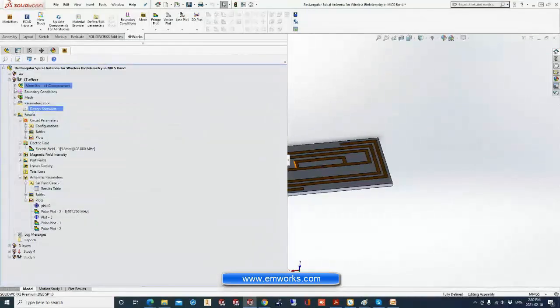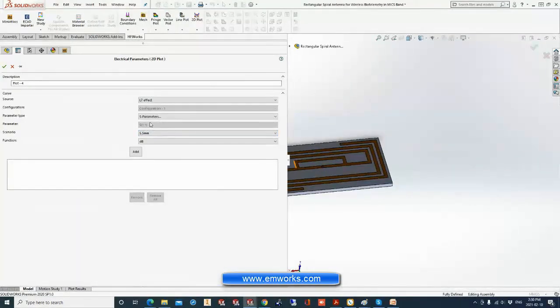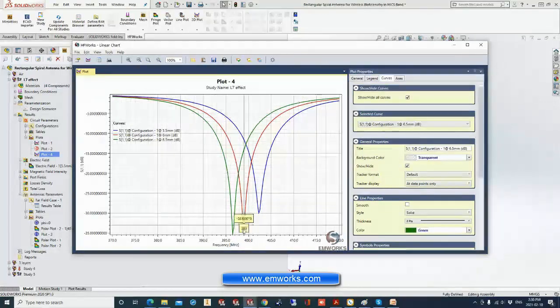After solving the problem, I got the results. We can plot the S11 parameter versus scenarios. I have 3 scenarios, so I can add the S11 versus all scenarios. Add. There we go, so we have the S parameter. See, it affects the band, the resonance frequency. The green one is at 6.5 millimeter, and the blue one is at 5.5 millimeter. The original one was this dimension, 5.5 millimeter.